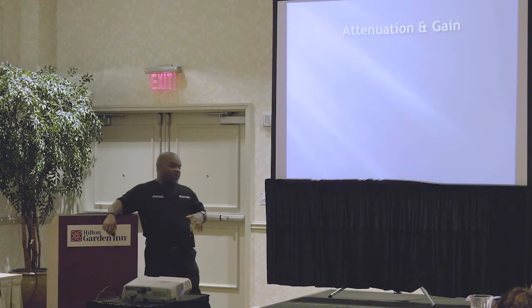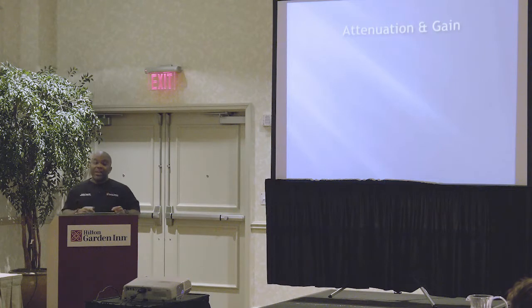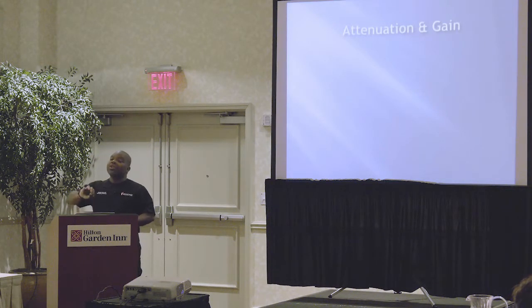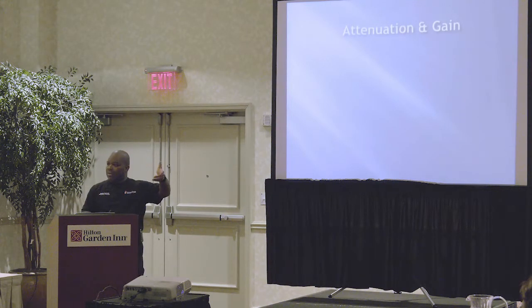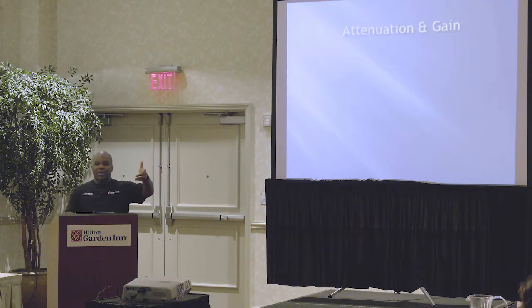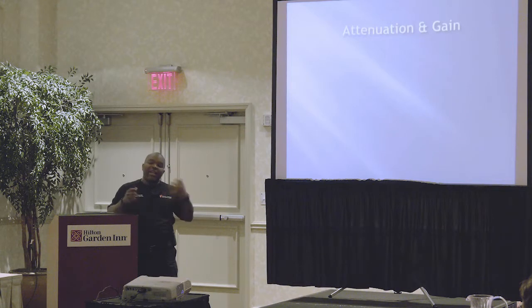So I always tell folks, if you're getting ready for work and you listen to your Justin Bieber in the shower and you can't hear because the shower is so loud, what do you do? You turn up the volume of the radio, right? Now you can turn the volume up as high as you want, but what happens to the quality of the sound as you turn your volume up? It gets worse, right? So by the time you go from 5 to 12 on your volume button, when you get to 12, you can't hear much, a lot of sound. Well, the same thing happens to the ultrasound, all right?